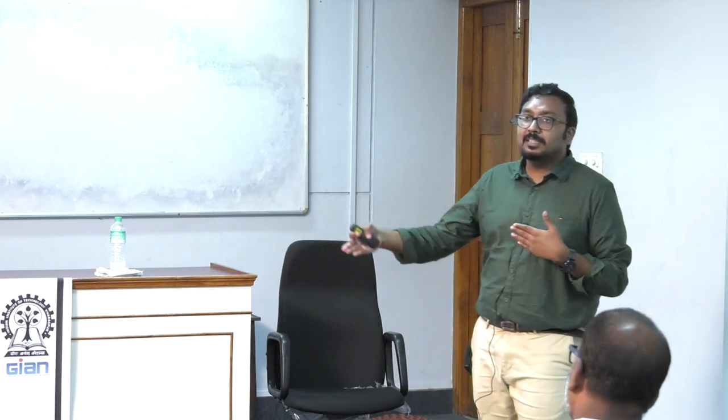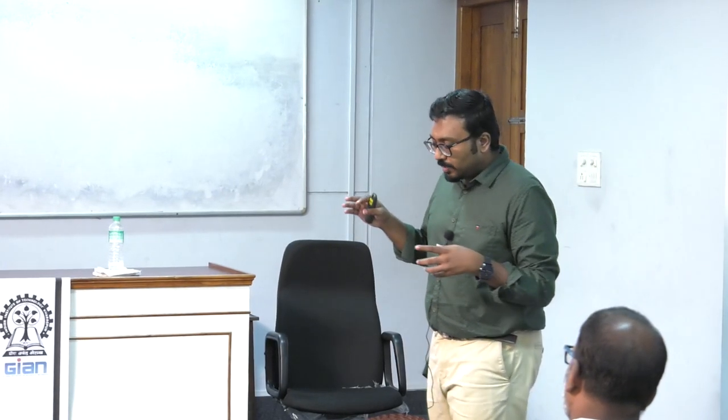So body responses are very similar to the inflammatory and immune response. Like when you have a rash or an allergic response, that is exactly what happens when the blood is in contact with the hollow fiber membrane. So that has to be avoided. Like I said, I am not getting too much into detail of that, but I will show you some things that we have done.